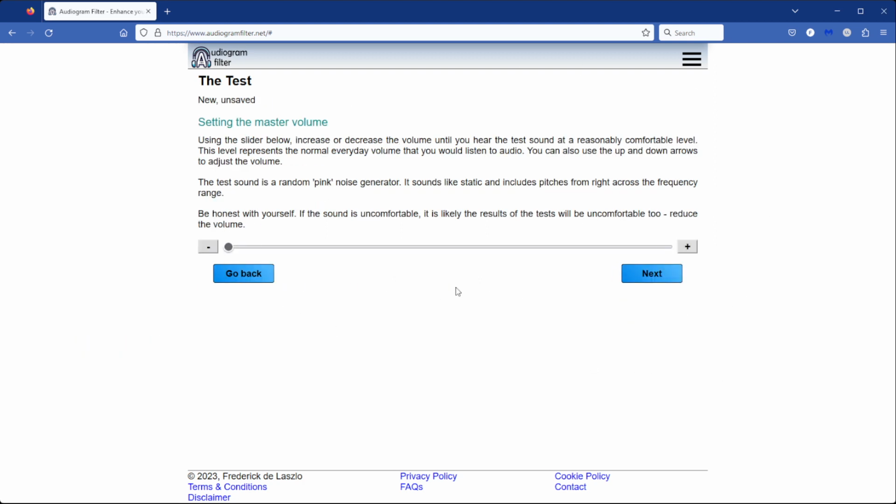Now here we have to calibrate the system somehow. Remember I told you, when you go and visit an audiologist, you would invariably sit in a booth, wear a pair of headphones, and so on. Everything in that scenario has been calibrated. The particular parameters of the headphones are known, the system is known, the software is known, the end results will be going into a hearing aid where all the various parameters are known.